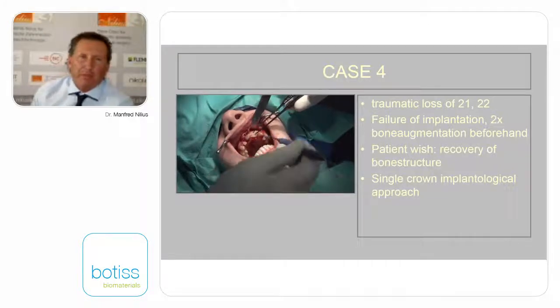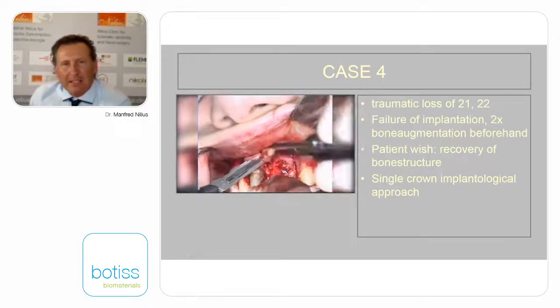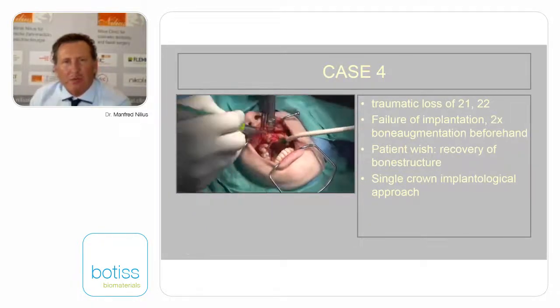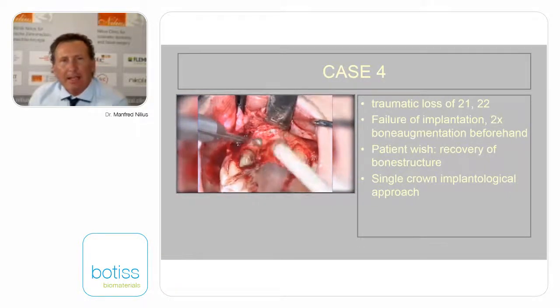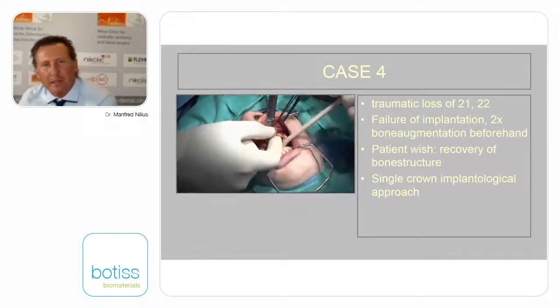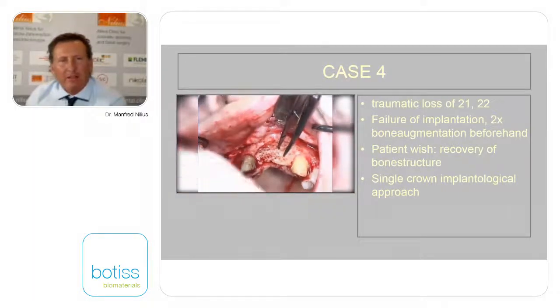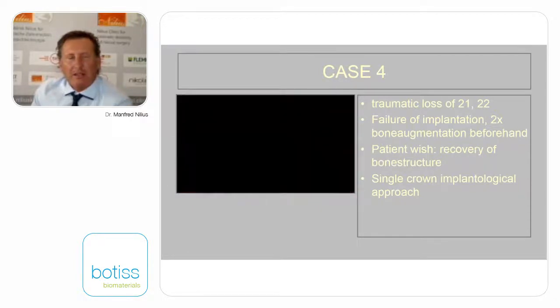When you do the planning together with botiss, please tell them that they make a small extension for covering the lateral teeth as well. Here you can see it on this side normally, yes. It makes it better for you to find the correct position of the Bonebuilder. Sometimes it's moving a little bit, and this extension gives you a very, very good fit.